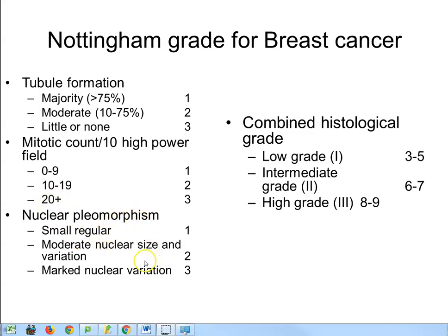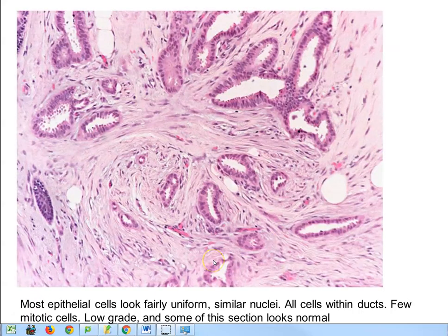Nuclear pleomorphism is how variable the nuclei are. A prominent nucleolus is generally a bad sign, whereas small regular nuclei are a good sign. If cells have very different nuclei from one to the next, that scores three — a very bad sign. Here's a very low grade tumour where all the epithelium is forming tubules. There's a swirling pattern suggesting tissue remodelling. The nuclei of adjacent cells look pretty much the same, and there are no visible mitotic cells. This may be very similar to what you see on the day.